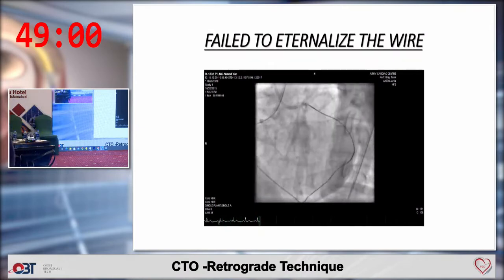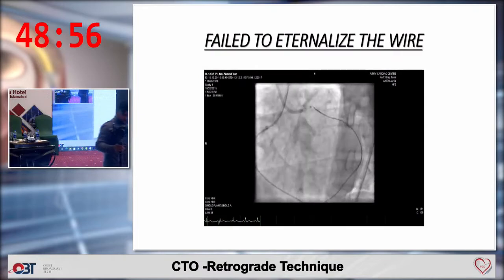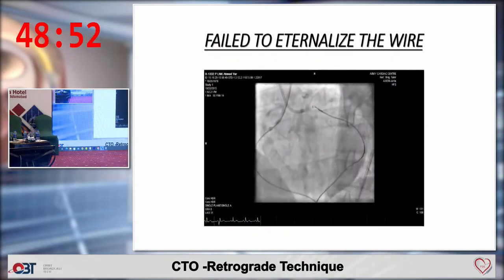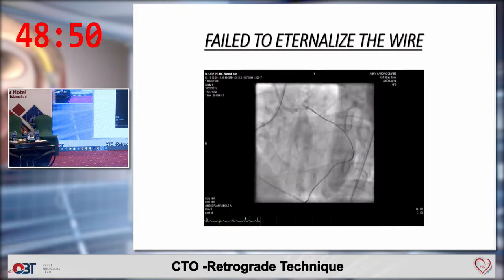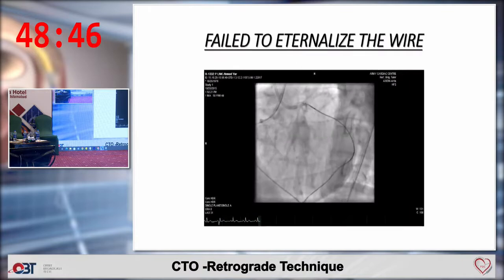So what did you anticipate in this case? Why was the externalization quite difficult? If the wire is in the lumen, it should go into the guide. I mean, is it subintimal? What were you thinking, and why did you take the guide liner? What were the reasons behind that?